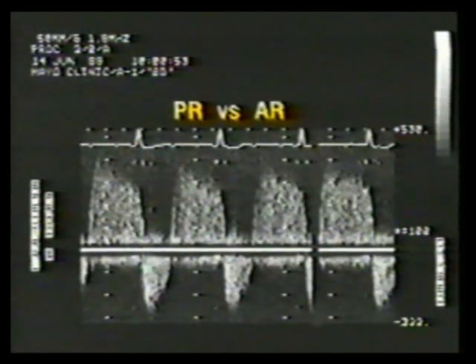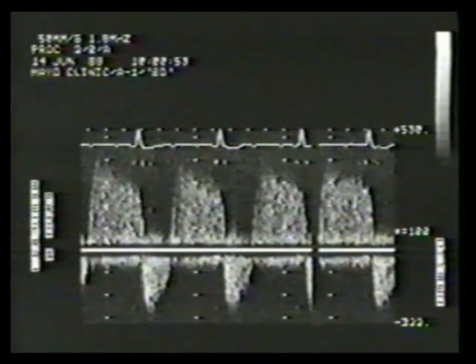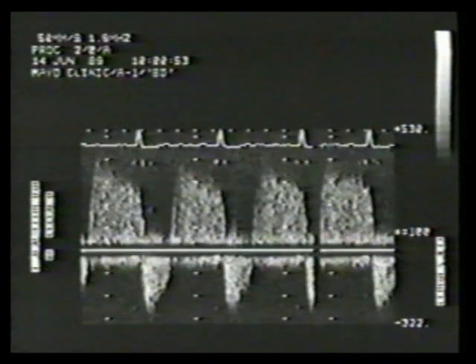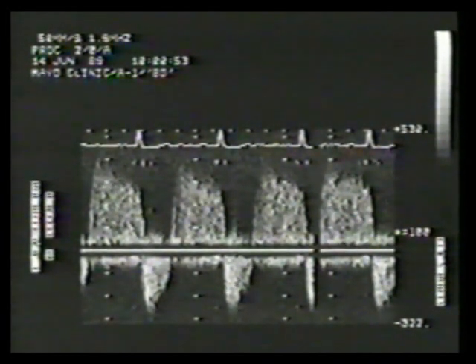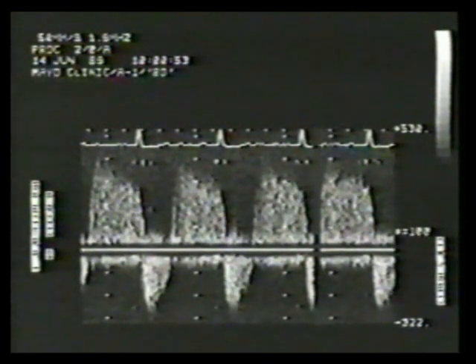Since aortic and pulmonary regurgitation are sometimes detected from the same transducer position, it is important to identify clues that differentiate the velocity spectra. This 88-year-old female had moderate aortic stenosis with associated regurgitation. Both aortic and pulmonary regurgitation were detected using an apical position for the non-imaging probe.